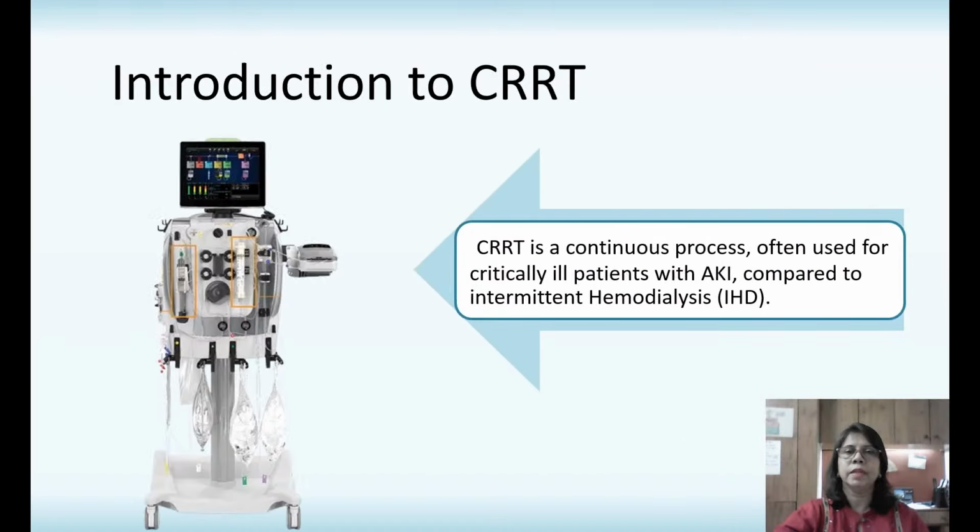Although intermittent hemodialysis is fast, cost-effective, produces pretty efficient removal of solutes, and is used in life-threatening conditions, CRRT has its own place in the treatment of critically ill patients with AKI, and let us see how this is more beneficial in some cases.